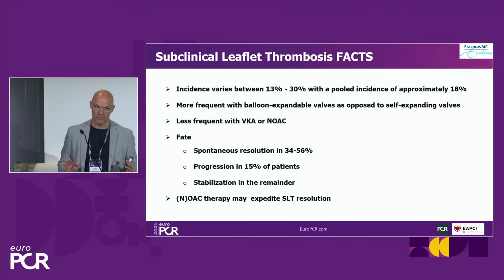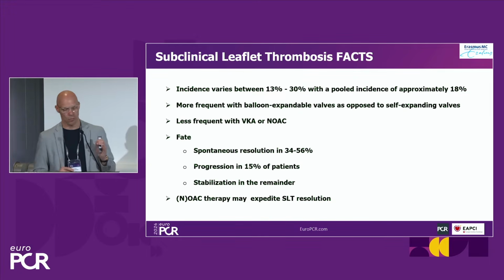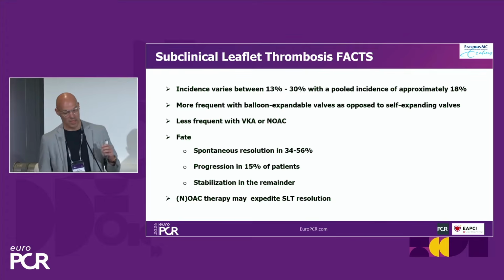Now, a couple of facts. Is it common? It's fairly common. Up to 30% of the patients receiving a TAVI valve will have HALT at some time after the procedure. It seems to be more frequent with balloon expandable valves as compared to self-expanding valves. It is less frequent with patients on NOAC or vitamin K antagonists.